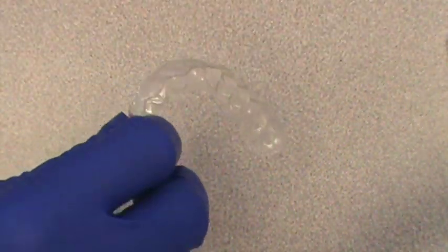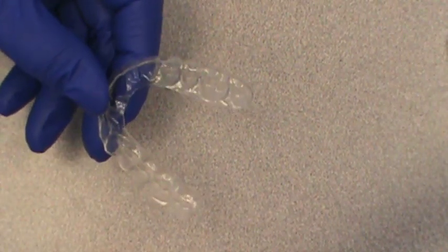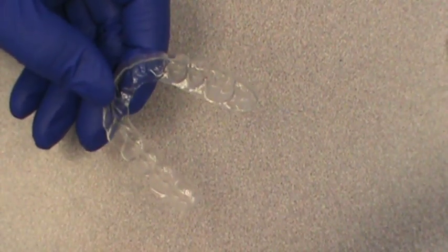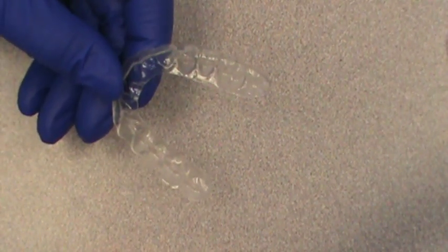These types of retainers require special cleaning and care as well. You can use special retainer cleaner that's been designed for these light plastics, or you can just use a toothbrush and regular water.